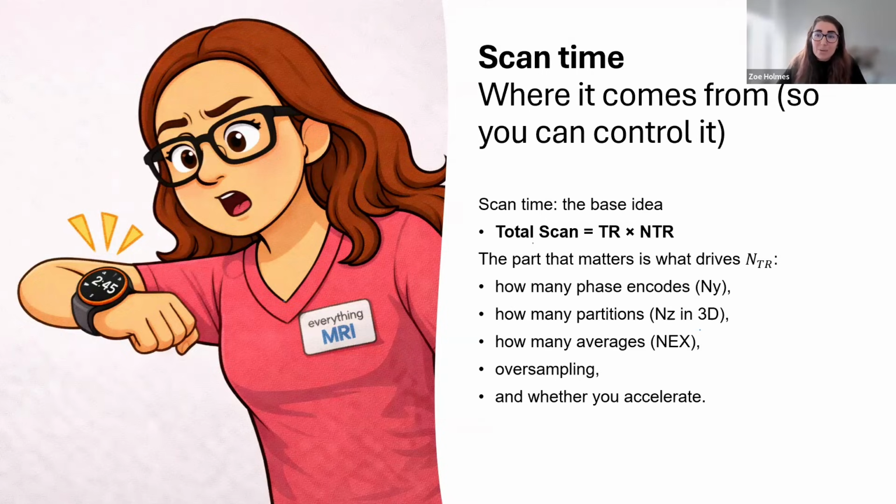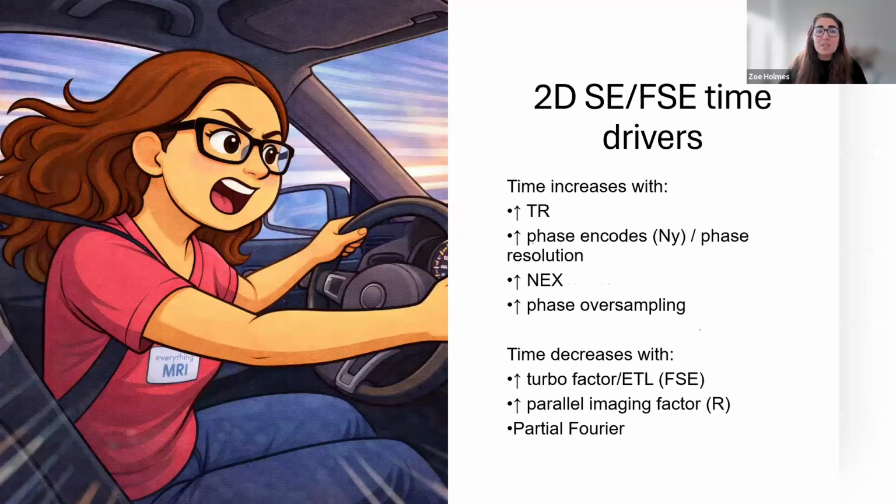If our patient is stable and we do have the time for it in our bookings, and the image is noisy, you can spend that money to buy your SNR back. But think about the clinical context, think about your current situation. Is that actually what you need? Use your clinical judgment. This is a big thing in MR. It's all about your clinical judgment and understanding where you can and can't buy that time back.